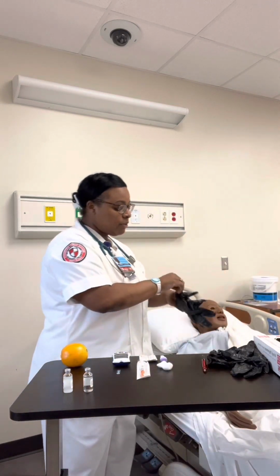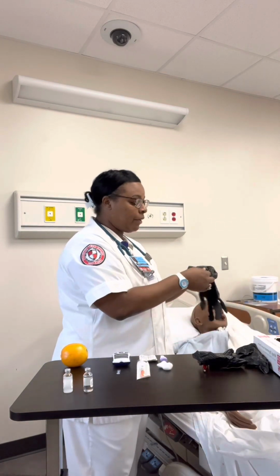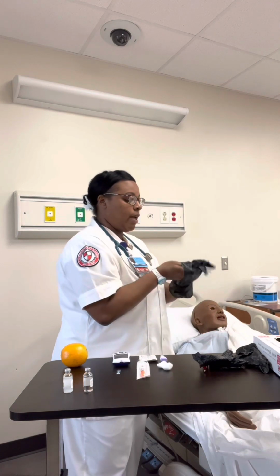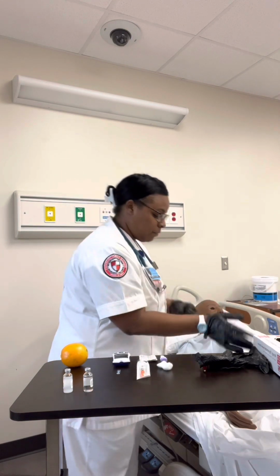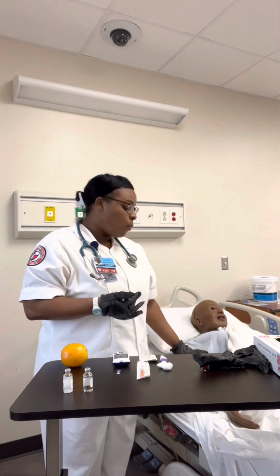To verify my patient, I'm going to have them state their name and date of birth and compare it with their armband. I'm going to have my client wash and dry their hands. I'm going to turn on the glucometer and insert a test strip.